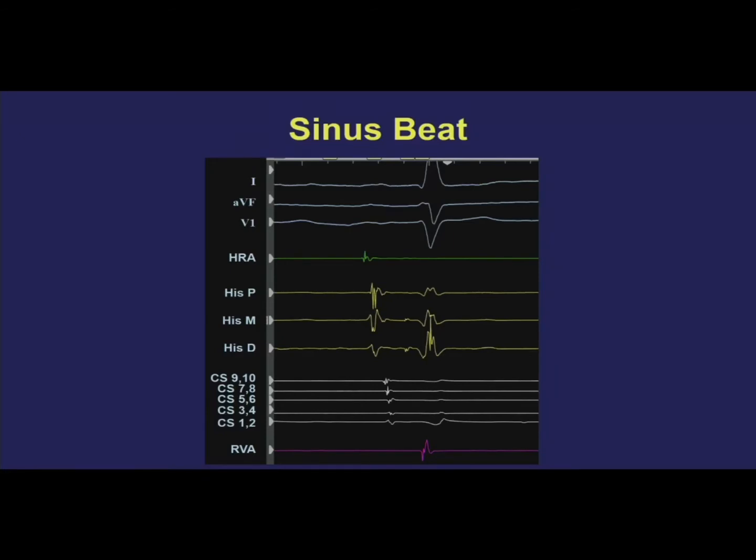so you don't perforate or puncture that vein. And a third is that most of us nowadays put a catheter in the coronary sinus from the groin, where we go up to the right atrium, deflect it, and it tends to ride on the roof of the coronary sinus, which is a little bit more atrial. But in the older days, and still now, many people will insert a coronary sinus catheter from the internal jugular vein, and then it travels down to the right atrium and travels on the floor of the coronary sinus, which tends to be more ventricular. So you might have more ventricular signal depending on the approach to the coronary sinus.